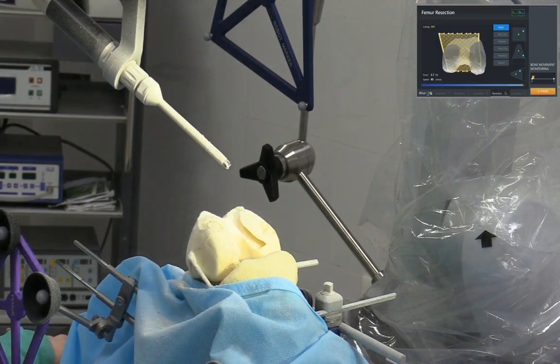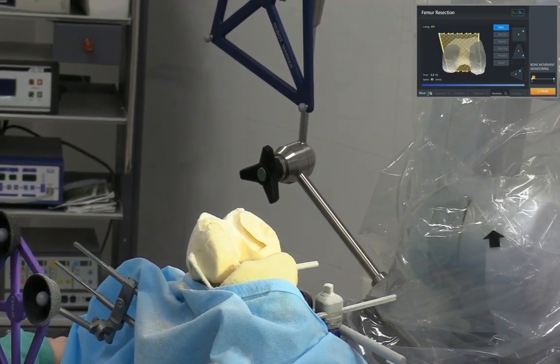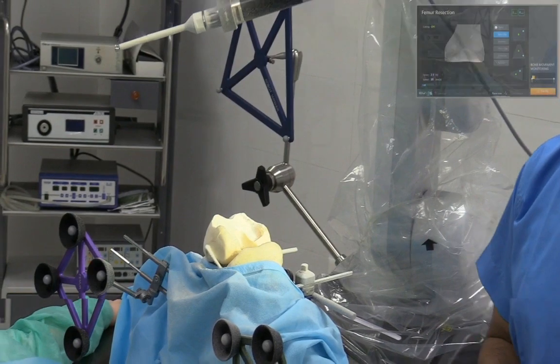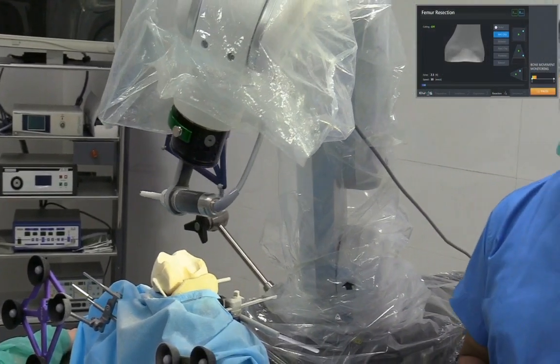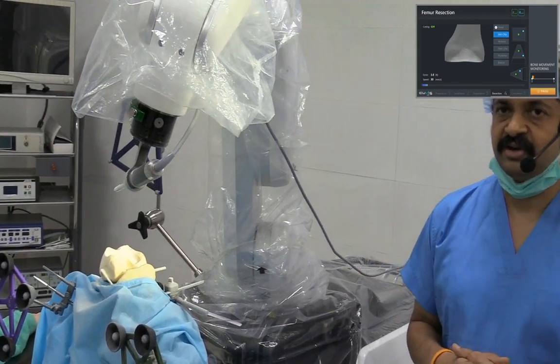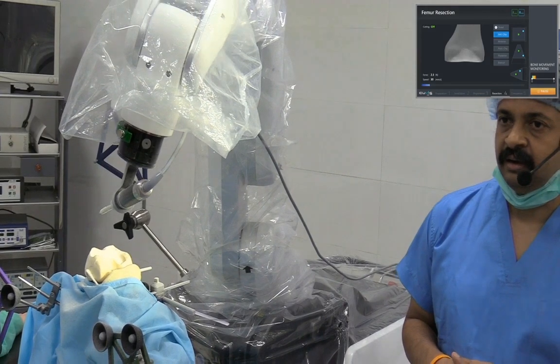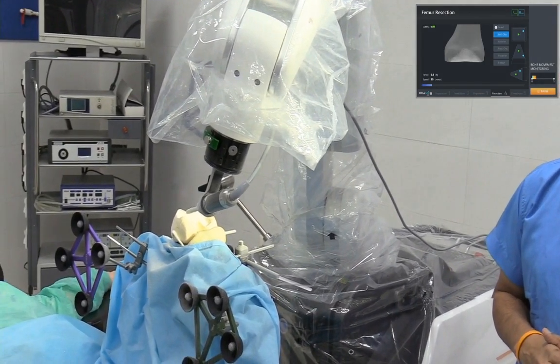As you can see, the distal femur is completely resected. So the distal femur cut is done. And as you all can see on the computer screen, the next cut is your anterior chamfer, and right now the cutting tool is approaching the anterior chamfer cut.